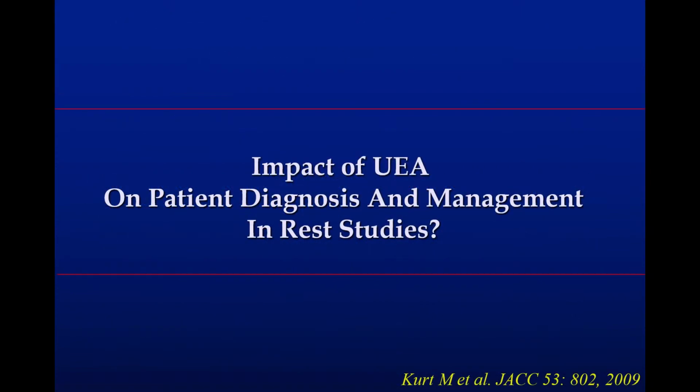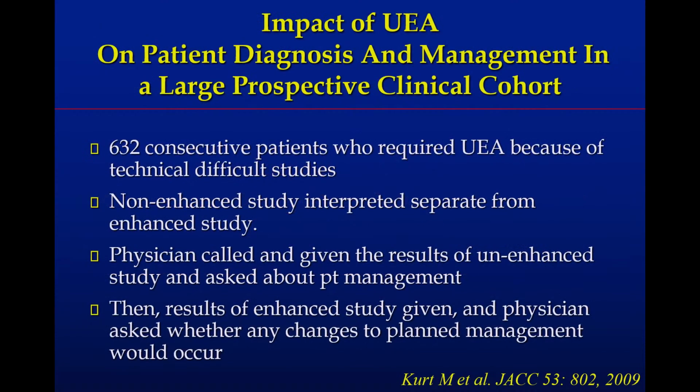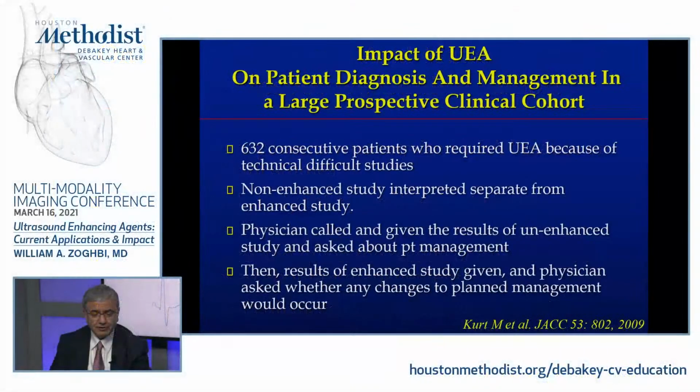What is the impact of ultrasound enhancing agents on diagnosis and management of patients? This is a study that we did when Mohammed Kurt was a visitor from Turkey with us. Now he's a physician practicing in Turkey, and that was more than 10 years ago.